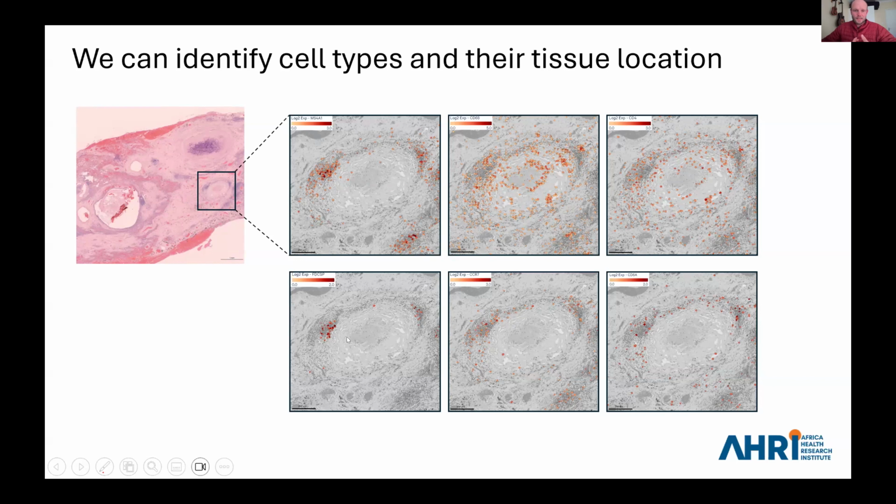And then what I'm interested in looking at is antigen presentation. So there are antigen presenting cells within these clusters. And then I was also looking at the interaction between B cells and T cells. So CCR7 is an important marker to look at here. And just to indicate that, yeah, the cells in these clusters are expressing CCR7, suggesting that B cells and T cells are coming together within these follicles.